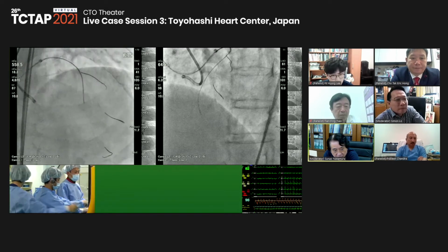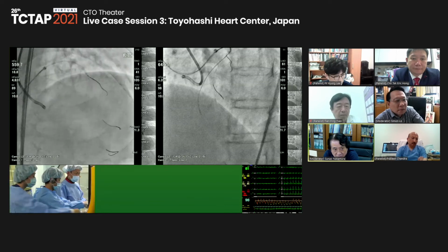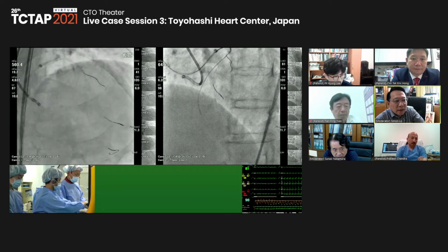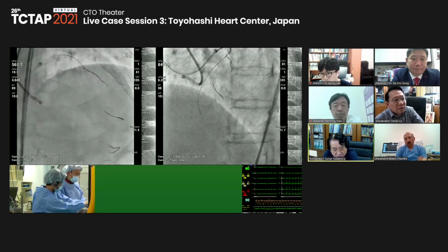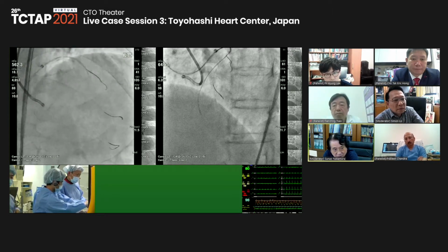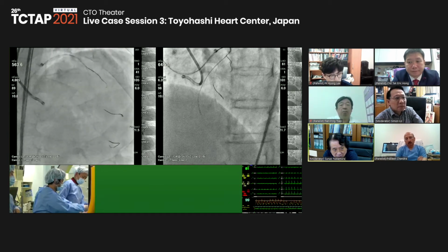And actually, we should not forget that this diagonal is a big one, and the most reliable one in this anterior territory. So maybe at least this big diagonal.